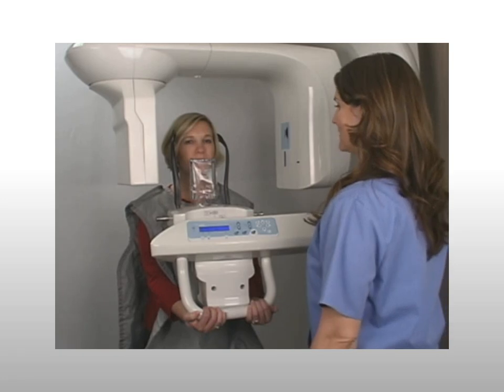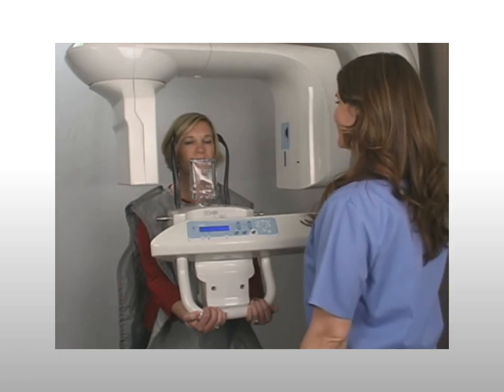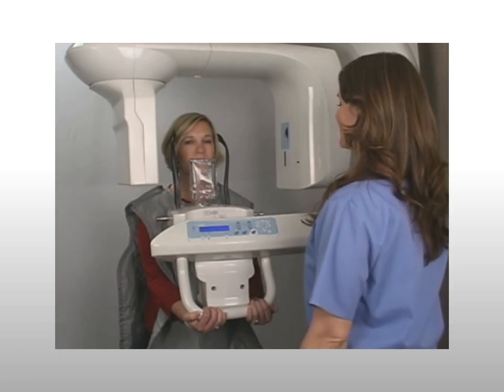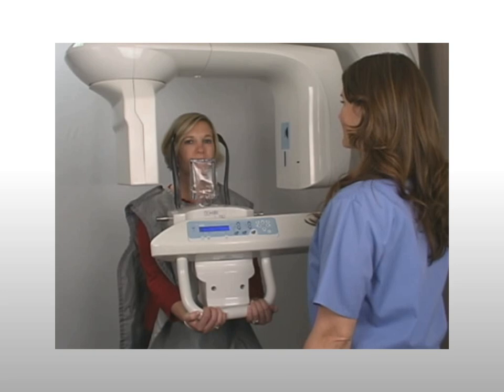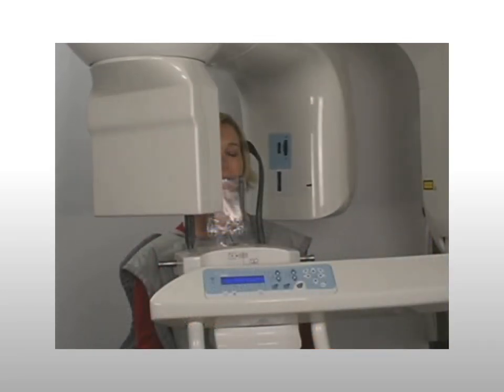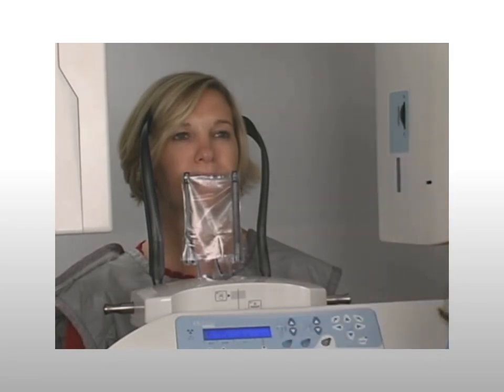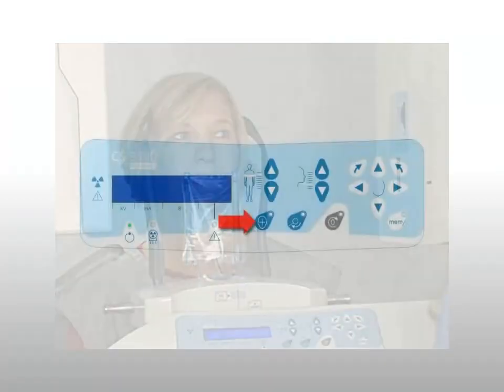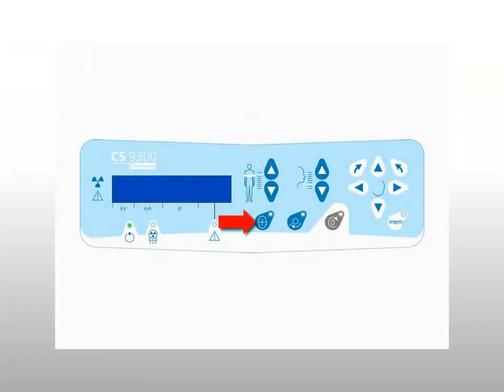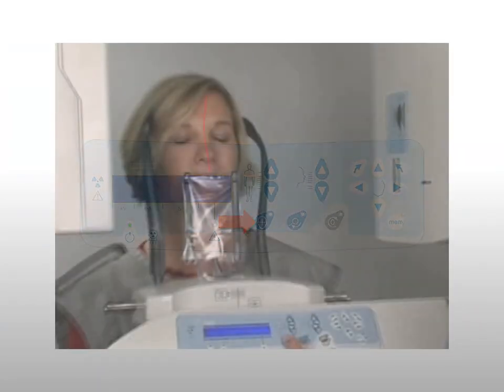Slowly close the temple supports to stabilize the patient's head. Next, instruct the patient to grip the lower handlebar underhanded. The underhanded grip relaxes and lowers the patient's shoulders, enabling clearance as the machine moves around the patient. Ask the patient to step forward and stand with both feet together. Explain to the patient the importance of keeping eyes closed to avoid exposure to the laser, then press the laser beam button to align the laser beams.